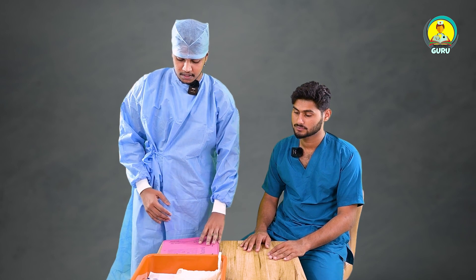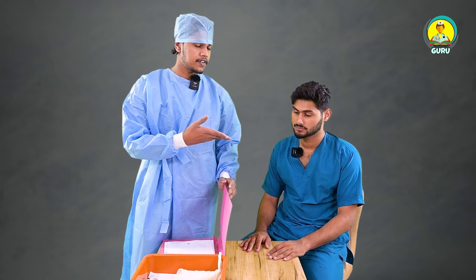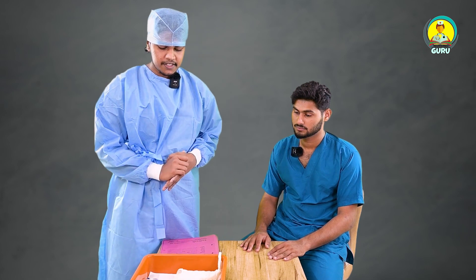So first of all we have to check the doctor's order, we need to identify the patient, and we need to explain the main procedures of the sample collection. Let's start.